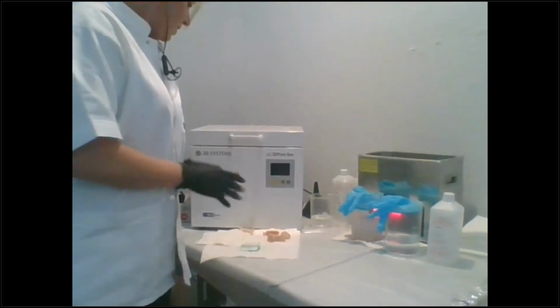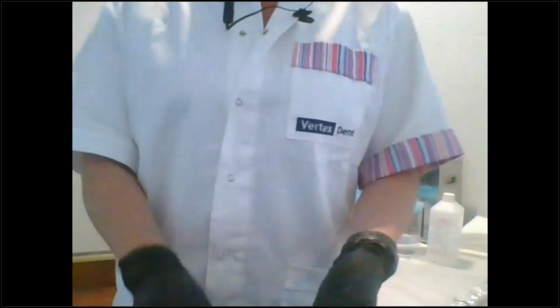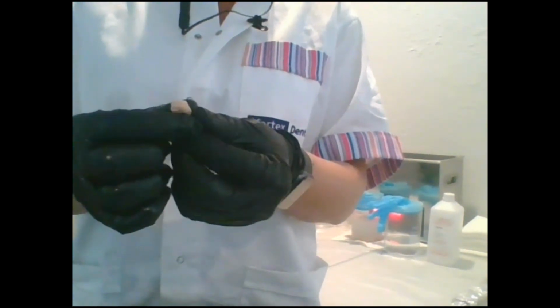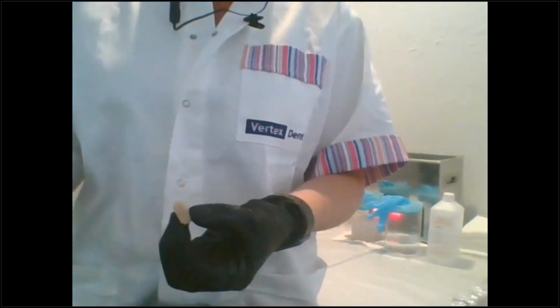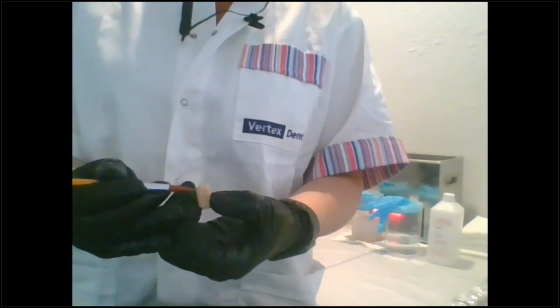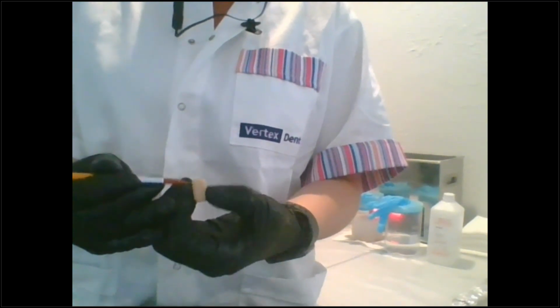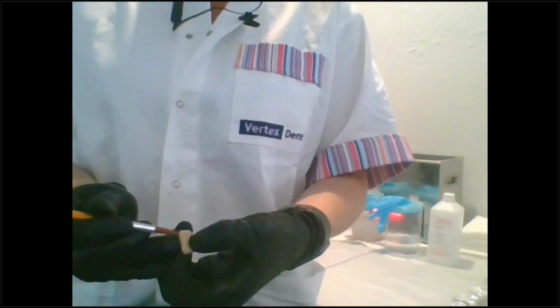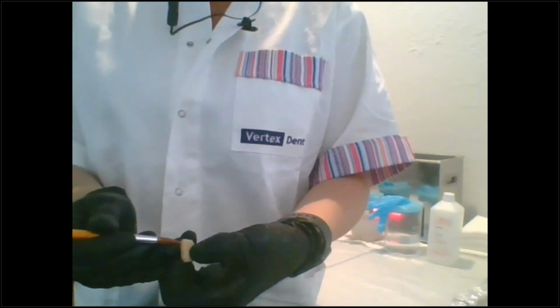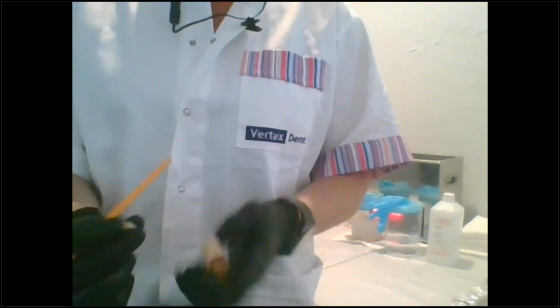And then I told you that I would show you that articulator. There's a couple of things that you do want to remember, and that's with your dies. So I have, this is an ExoCAD model. You want to have that margin have a little bit of reinforcement here. So I usually go 0.2, 0.3, something like that. And so instead of ditching it right under the margin, you'll let it go down and have a bit of a shelf, okay? Almost like a bevel, just for support when you're printing.